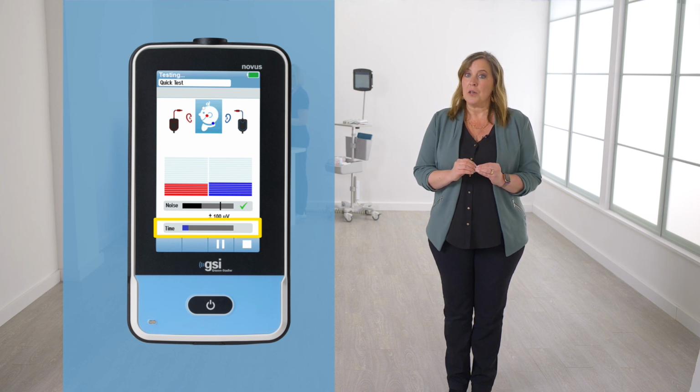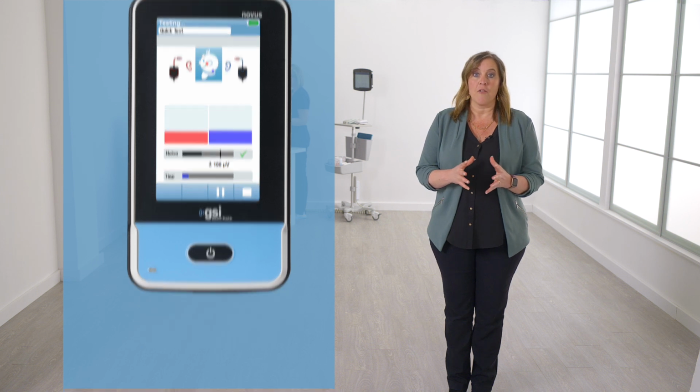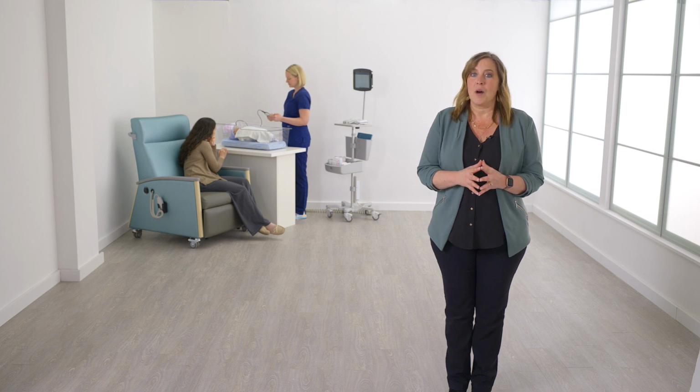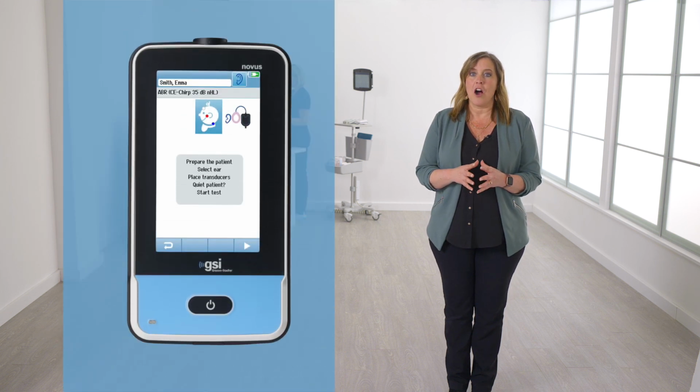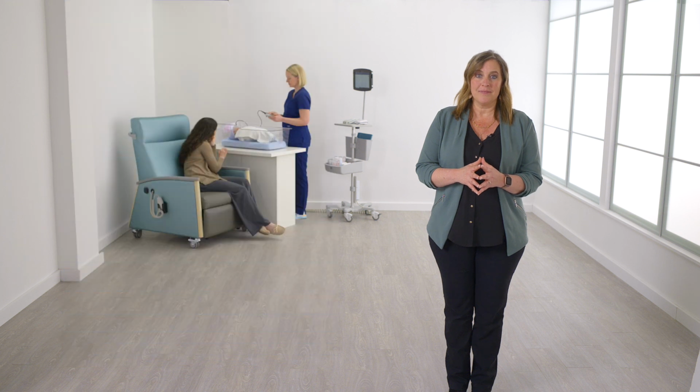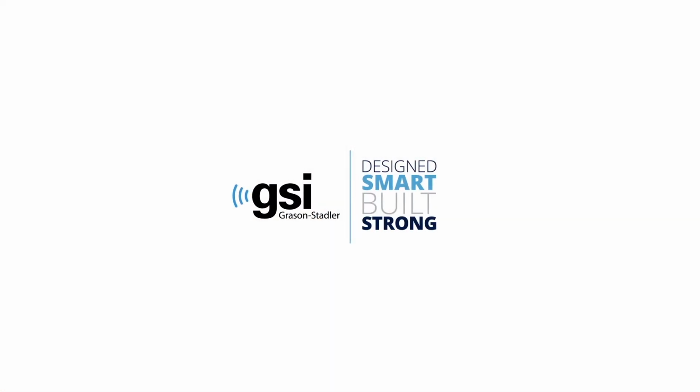The test will conclude when both ears have met the criteria for a pass result or the maximum time has been reached. It is possible to test one ear at a time when using the ear cups or ear tips. Touch the ears icon on the top right of the screen to toggle to the test ear. If you are using the OAE probe for AABR, a single ear icon will be visible and will toggle between right ear and left ear. The right ear is red and the left ear is blue.